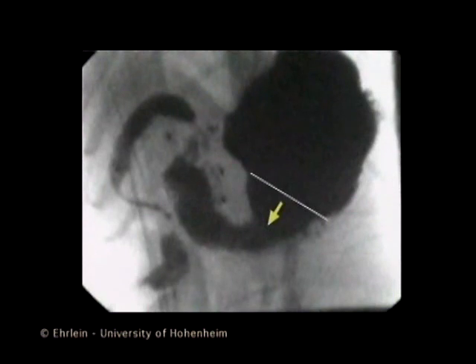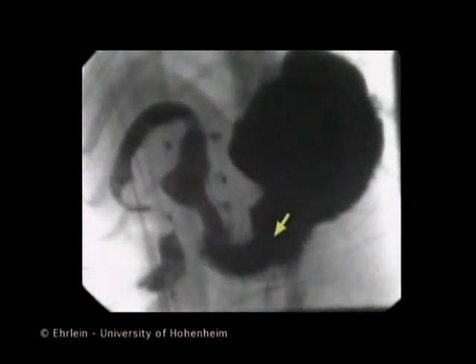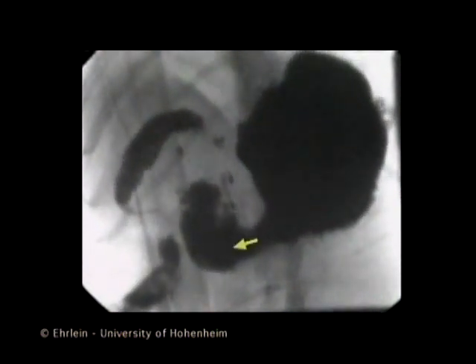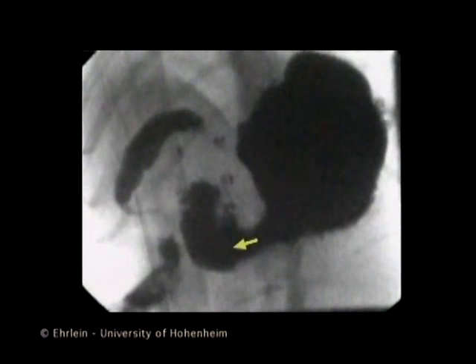Another peristaltic wave of the gastric body propelling a bolus towards the antral pump. The aboral transfer of the bolus can be clearly seen. Reaching the proximal antrum, the peristaltic constriction becomes deeper.